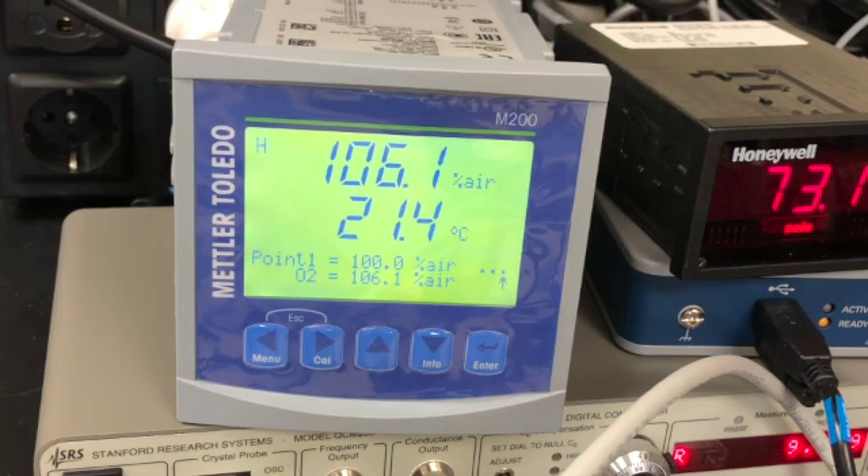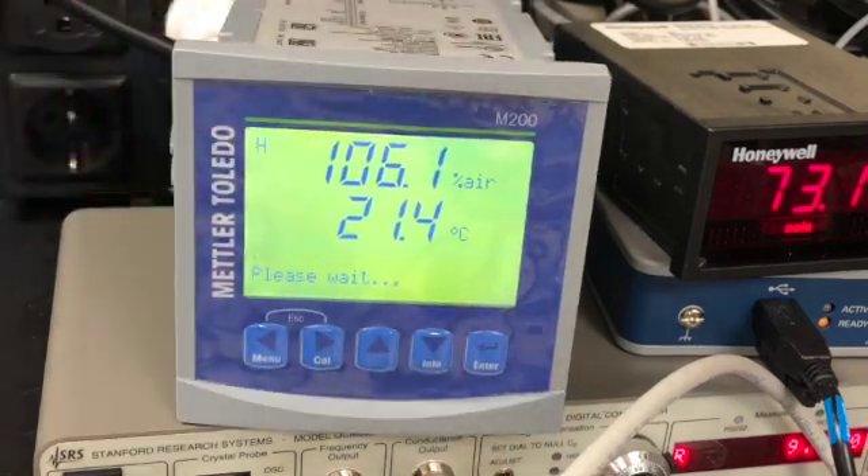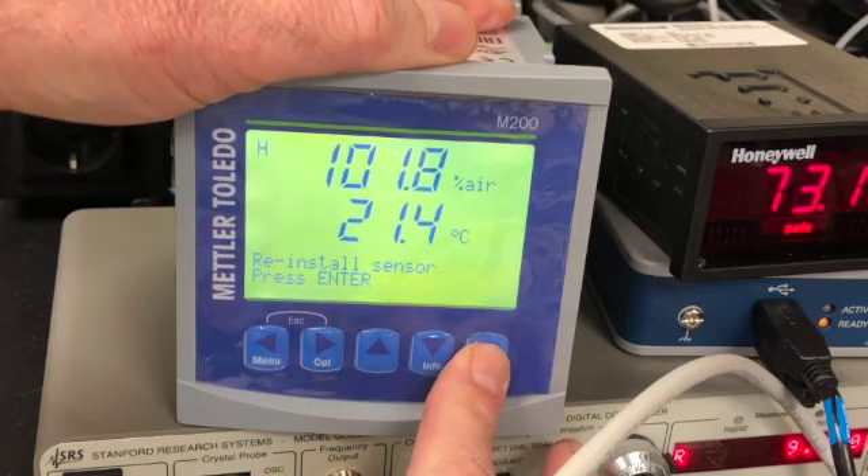After a while the stabilization time is done and now we press enter again. We wait again while the oxygen sensor reading stabilizes near 100 percent, and once again we press enter.